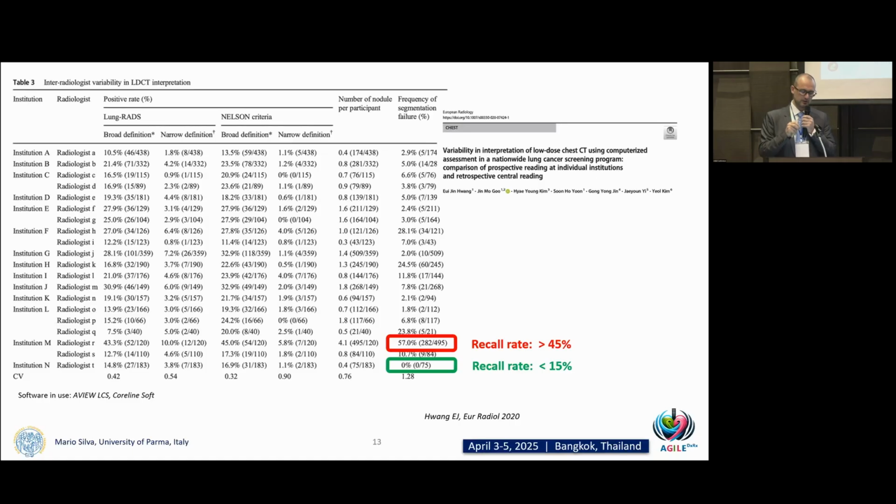This is done with an extremely quantitatively oriented software. So when you classify segmentation failure with the software, sometimes you have to cancel all the volumetry and draw it again. Or sometimes you can play around with quantitative features and say plus minus size or plus minus margin irregularity. This second case is the case of the software. So whatever change you do is actually reproducible in the next time points. And this is interesting, isn't it?